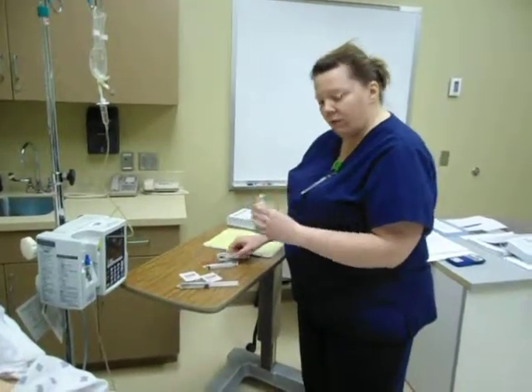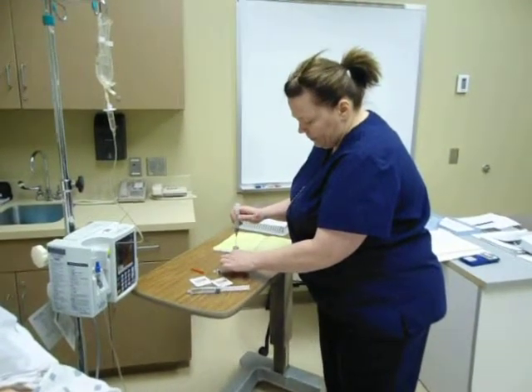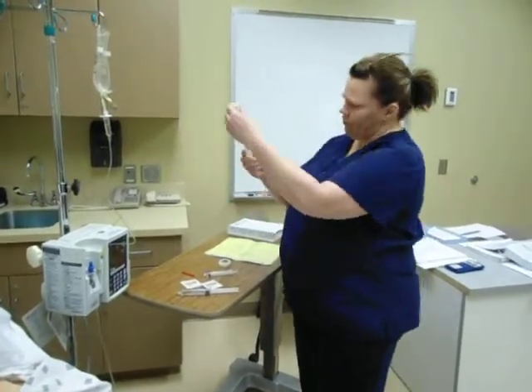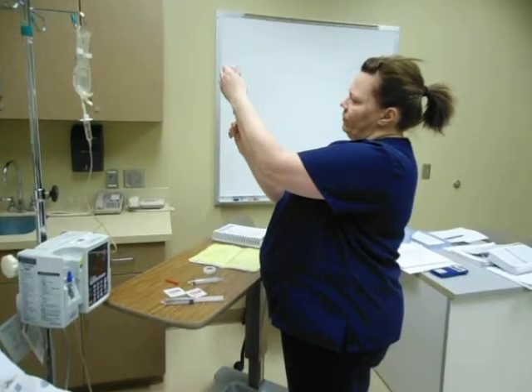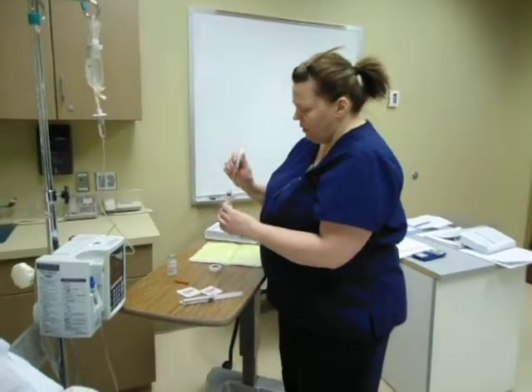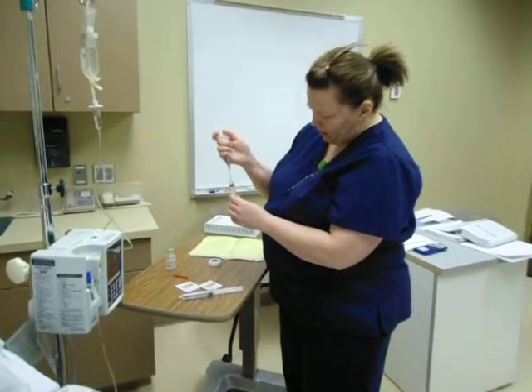I'm going to go ahead and draw up my Verapamil, and I've cleaned this off before I've done this. And I've already pre-gotten my 1 milliliter of normal saline, so I'm going to go ahead. I'm going to draw back first so I have some room to put my drug in there. And just make sure I get it all in there.